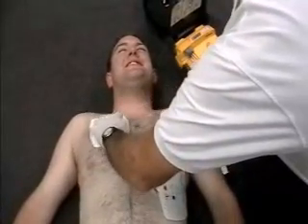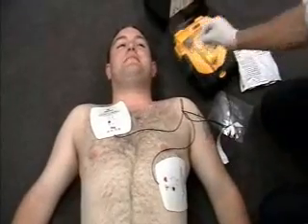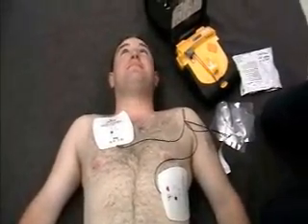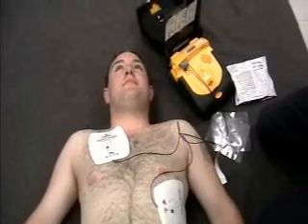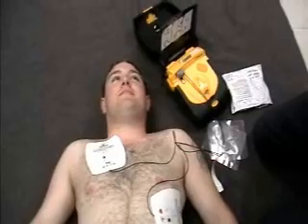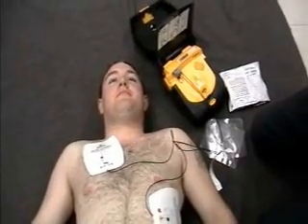The device repeats: 'Remove all clothing from patient's chest. Do not touch patient.' So now we're going to allow it to analyze. 'Don't move. Evaluating heart rhythm.' And the result: 'No shock advised. Provide chest compressions and rescue breaths.'